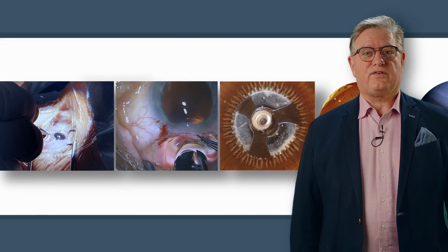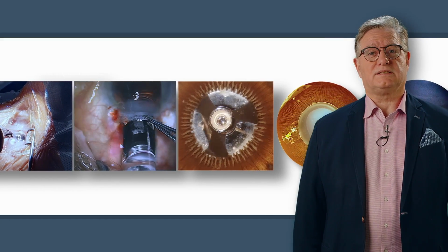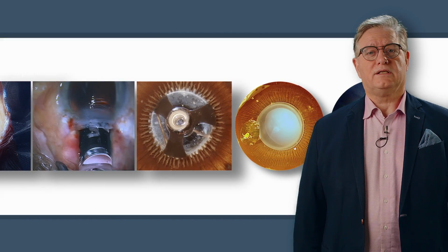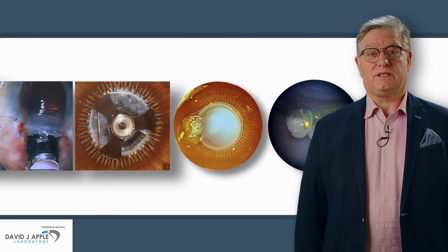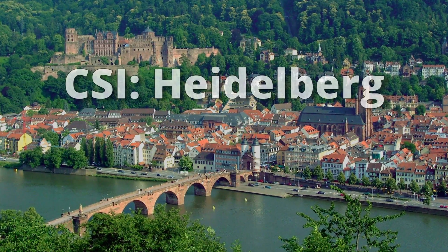So I hope you have had an interesting inside view of these new technologies and devices. As you can see at the David J. Apple Laboratory, we are also evaluating posterior segment procedures and devices. We will go on in more detail on these topics in another episode of CSI Heidelberg.